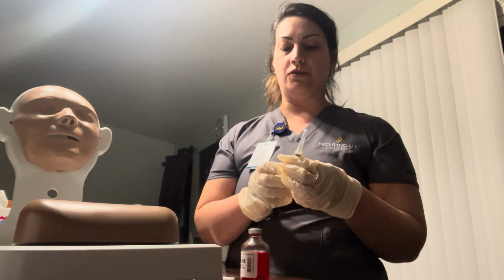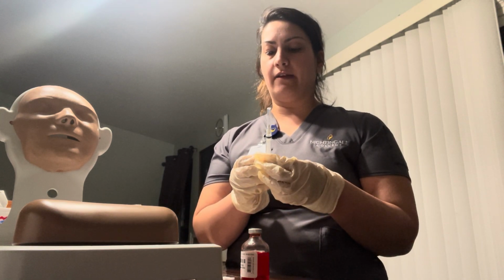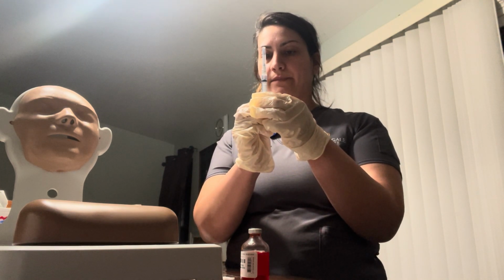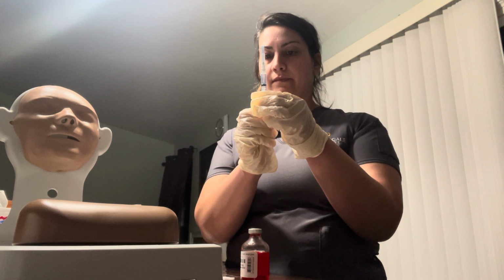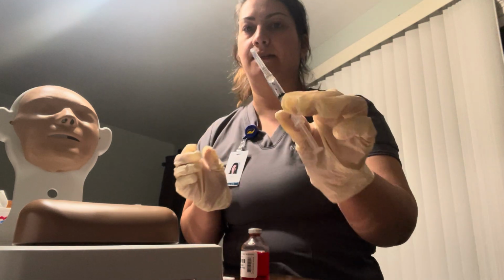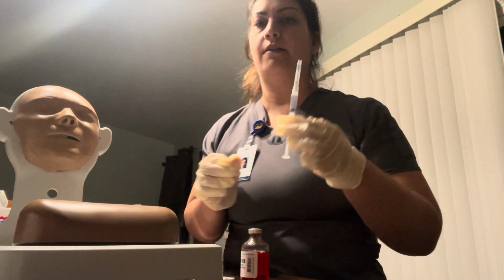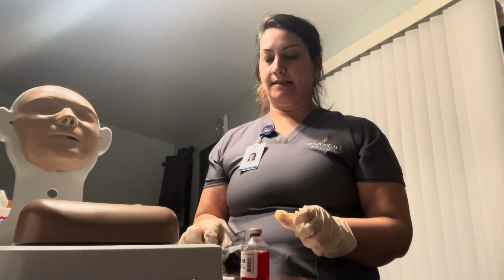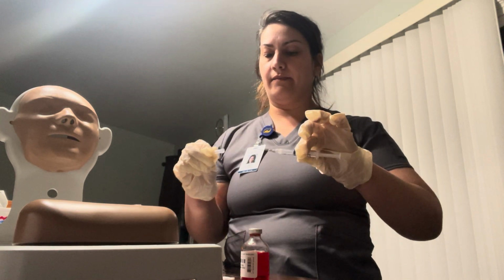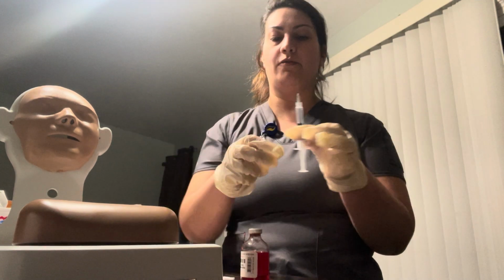Next, I'm going to draw in my air, 1.5 mLs. I will hold it like a pencil, pointing up. So 1.5 mLs. You guys can see that. Okay, perfect. Next, I'm going to take my 2 fingers here. I'm going to take off the cap. We'll use this next for the 1 scoop method.